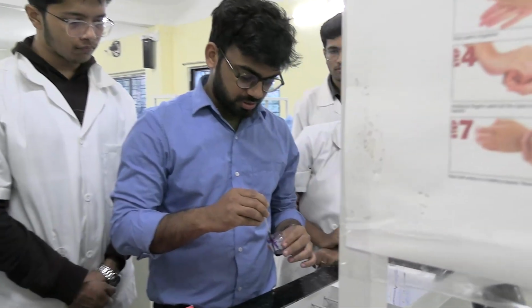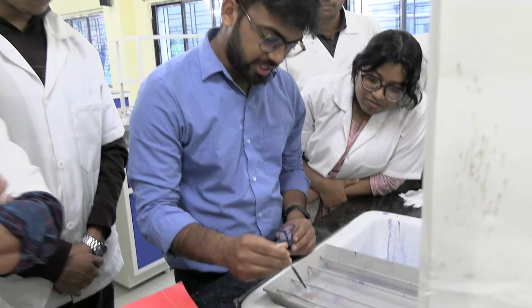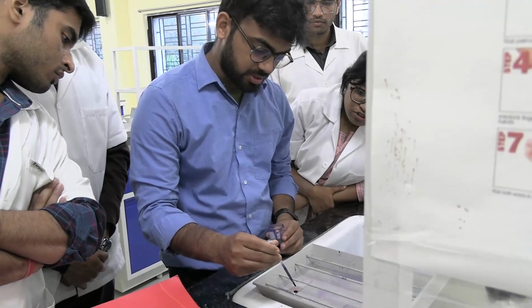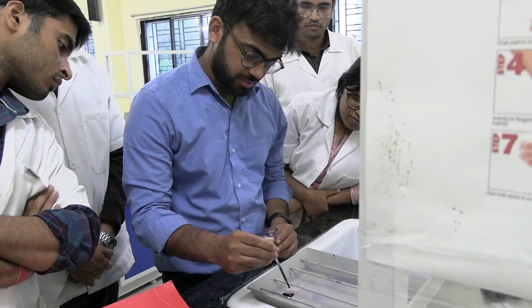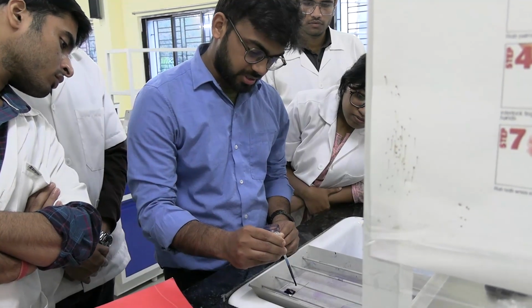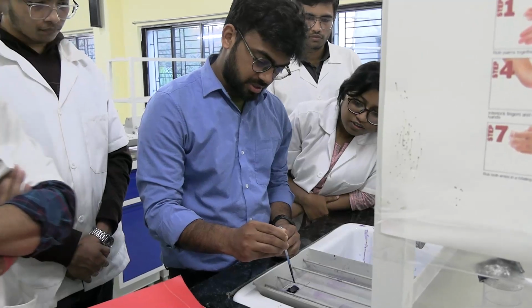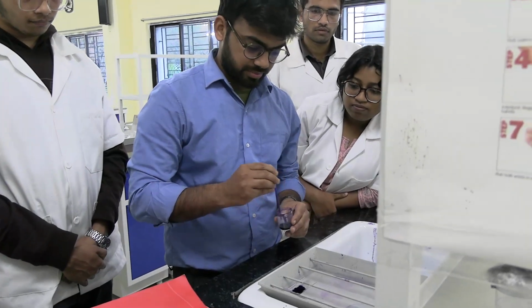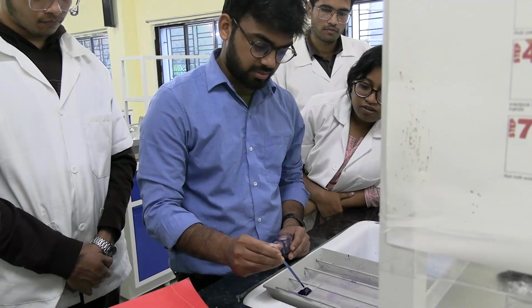Suppose I am going to place it over all of the smear area. How many drops? 8 to 10 drops. 1, 2, 3, 4, 5, 6, 7, 8, 9, 10. For how long? We need to wait 2 minutes.